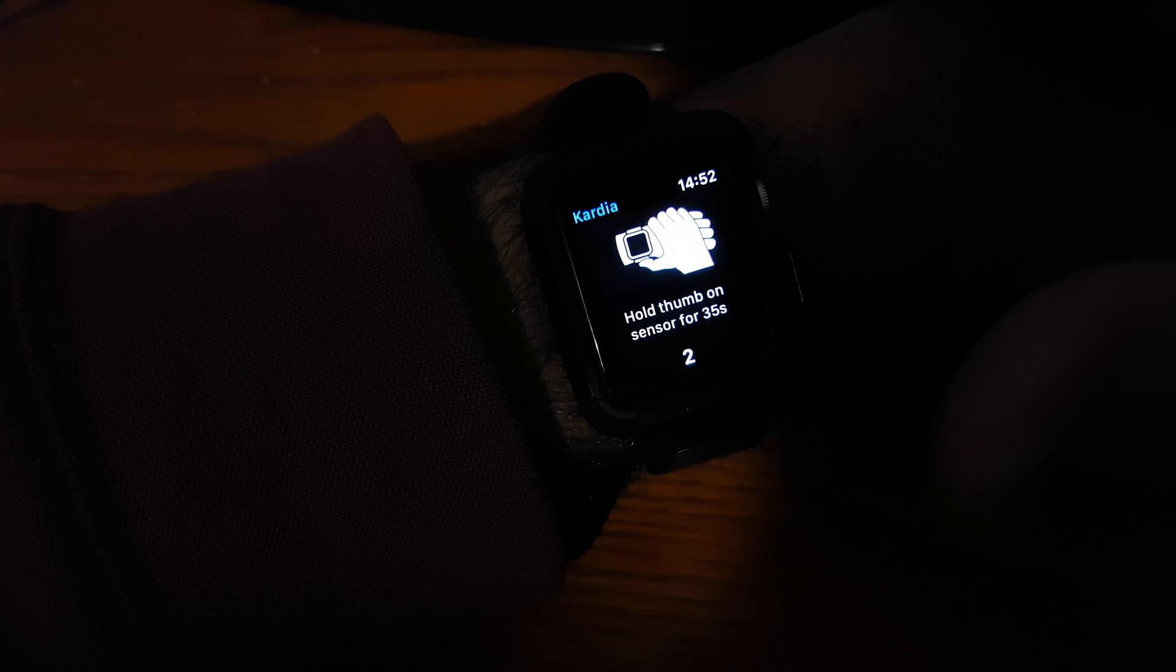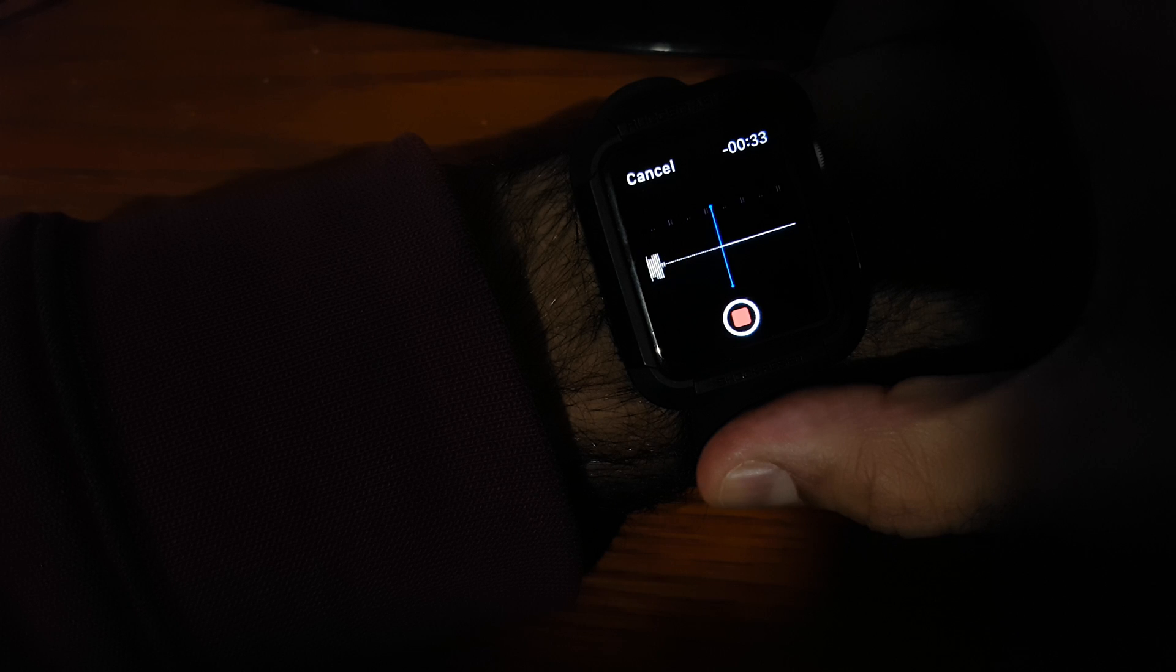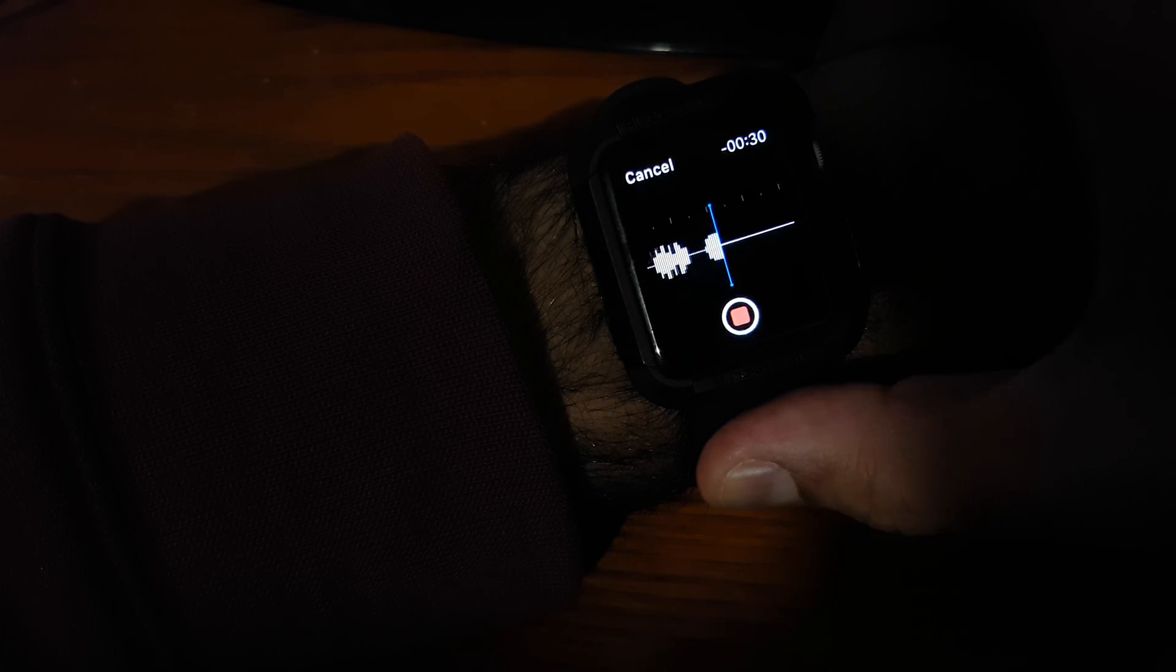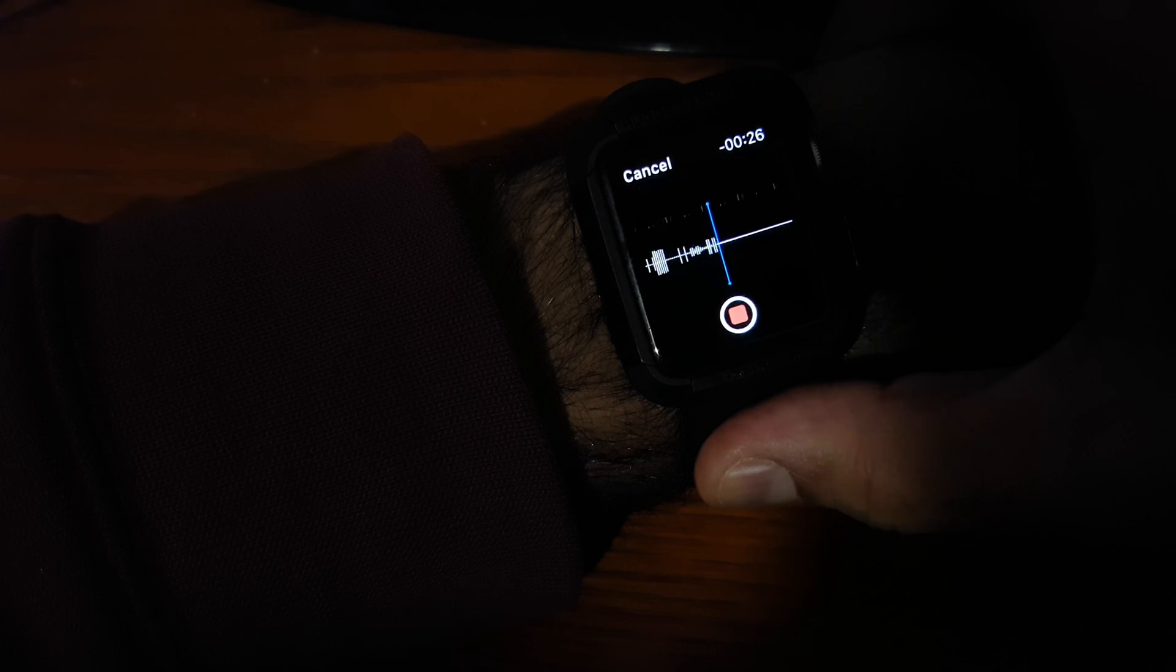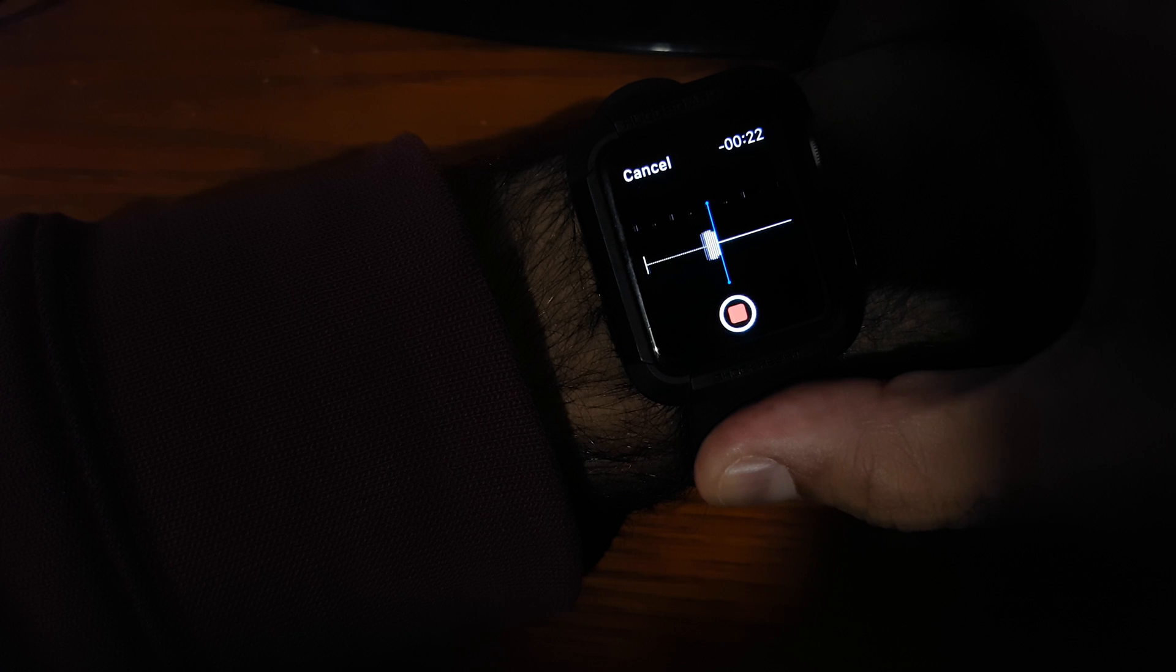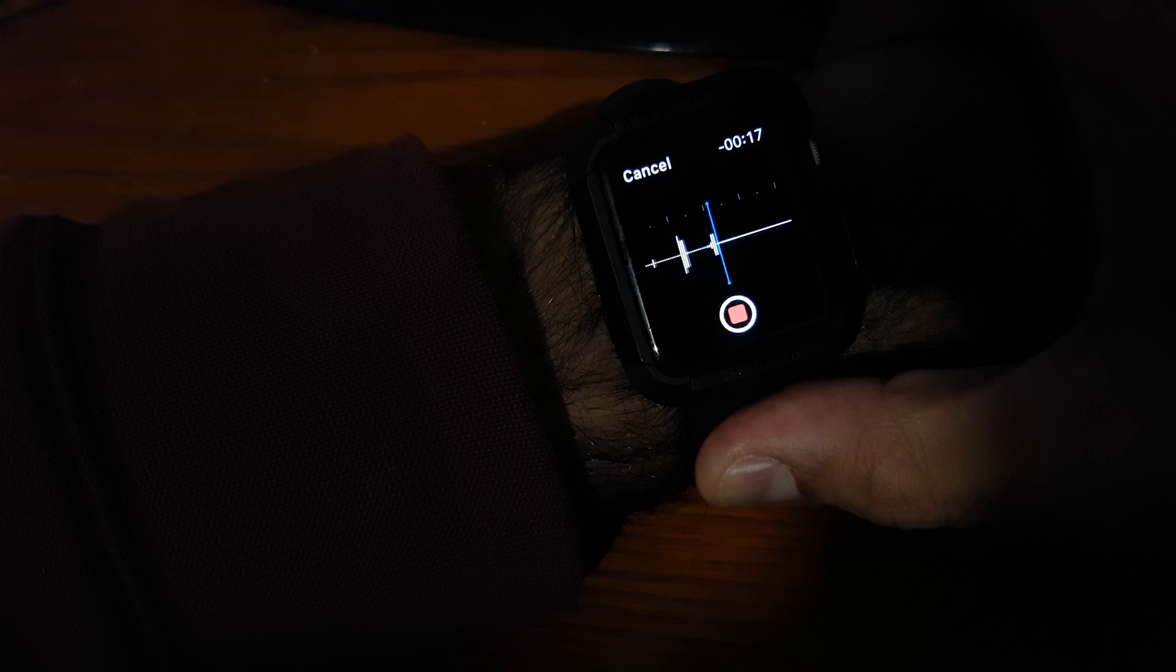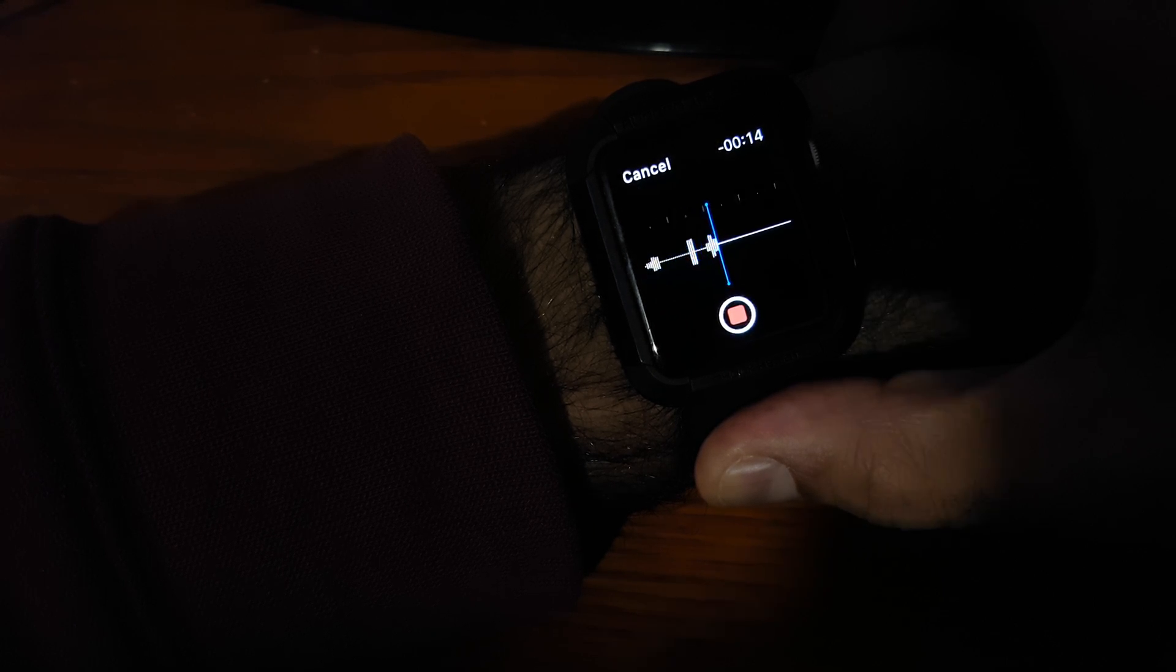Hold the thumb on the sensor for 35 seconds, so I just hold like that. And so you see when I'm talking, it's actually recording my voice there. So if I've said I've just had two cups of strong coffee, and I haven't, I've slept well, and it's raining, whatever I want to say, I'm feeling stressed, etc. Then it's capturing that along with my actual ECG recording.